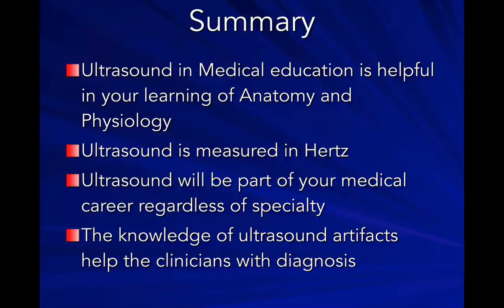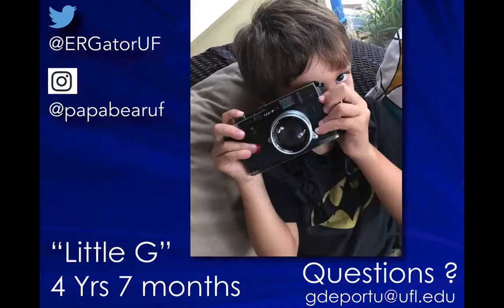So basically, in summary, ultrasound medical education is helpful in your learning of anatomy and physiology. We measure ultrasound in hertz. It will be a part of your medical career regardless of your specialty. And the knowledge of artifacts will help you to guide your diagnosis, basically. So that's kind of it.